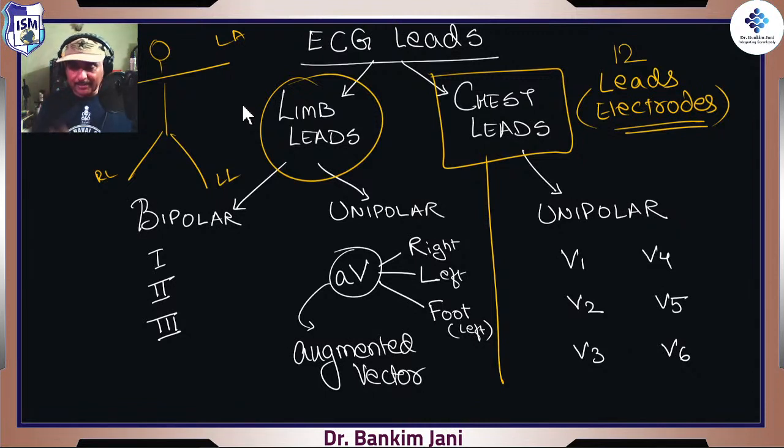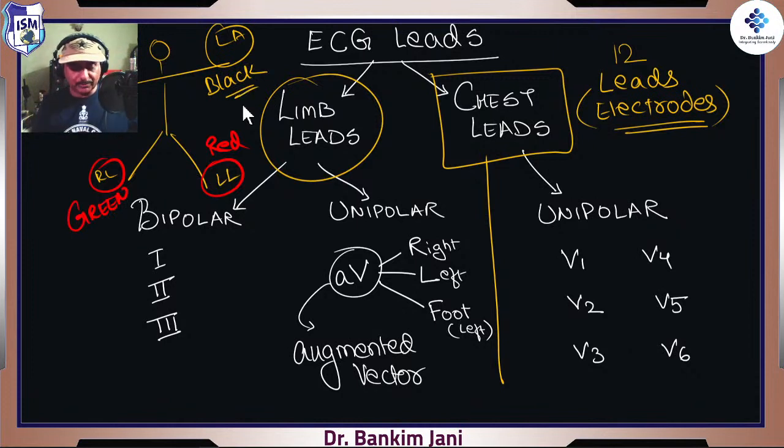When you drive your car, the accelerator is under your right foot, correct? So that is the right foot, so make it green. The left foot would be for brakes, so brakes are red. Then we say that right is positive, positive means yes, so white goes over here. The only thing left out is black, so black goes over here. These are just color codes to make it easy.